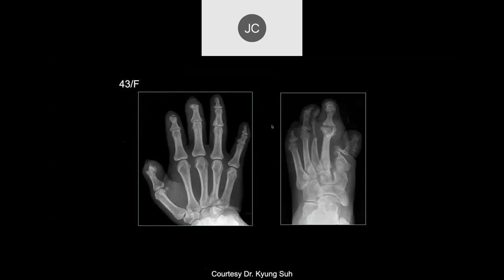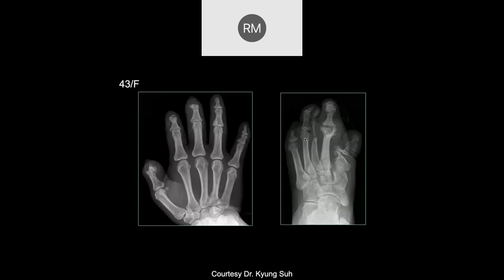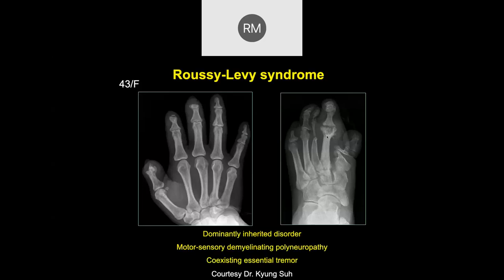43-year-old female with erosive changes of the distal phalanges, first through third, and a lot of abnormality. One could consider burn injury, or infectious diseases — for example, leprosy. But this is Roussi-Levi syndrome, an inherited congenital deformity.